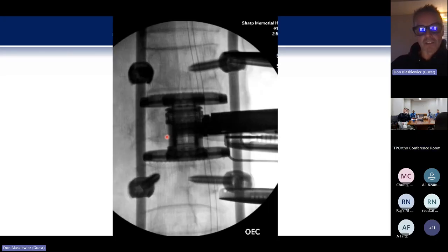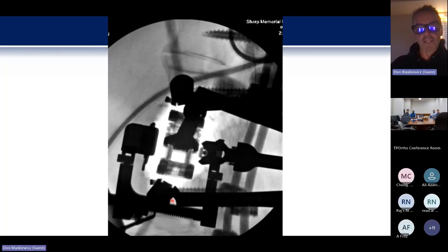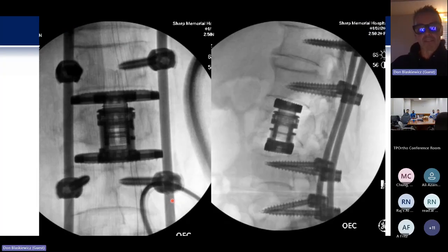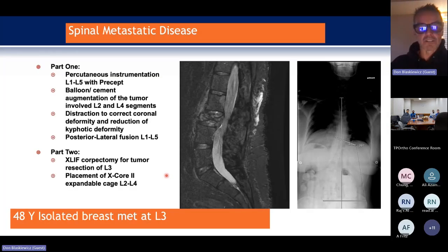And then when the implant's going in, gently tamping it in, again making sure the axis is in alignment with the posterior spinous processes, with end caps planned beforehand, what angles you want, and the finished product. Here we are post-op. All looks good.